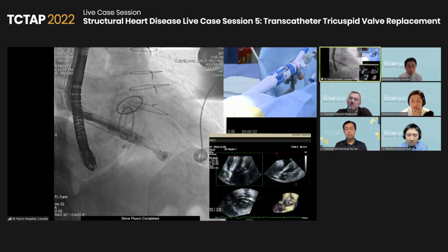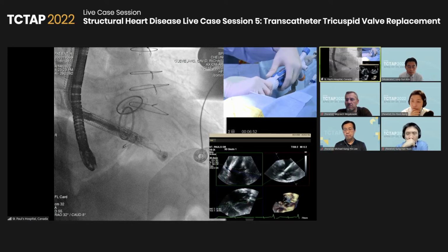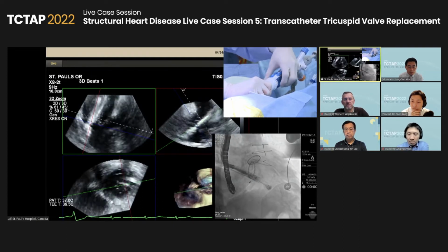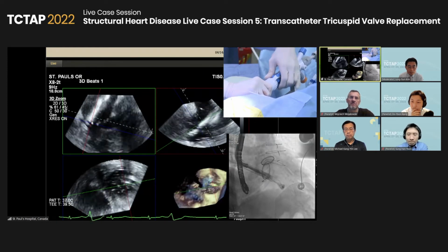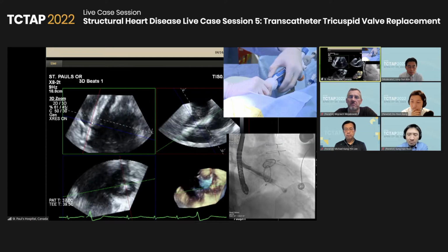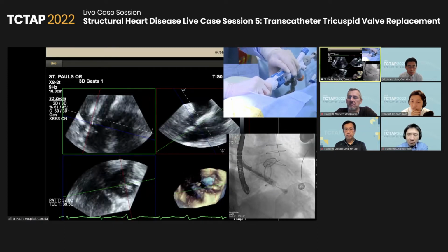So this is again the echo, Rob. So Anson, you've gone really posterior again. So you're okay on the medial lateral side, but you've got a really super posterior trajectory there. So what I would do is flex the catheter a bit more. So you see that will work, but it doesn't seem to do that. Just going to get at the phone there. Thanks. Looks like you might have come away a little bit there. Yeah.